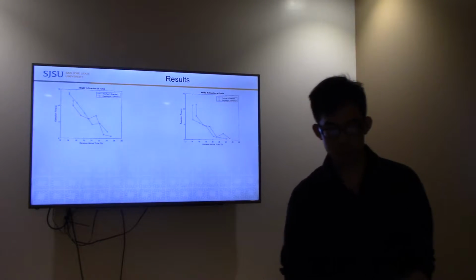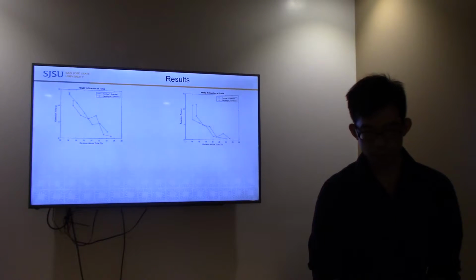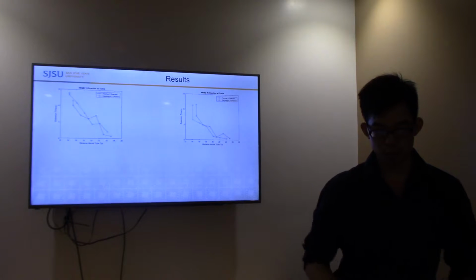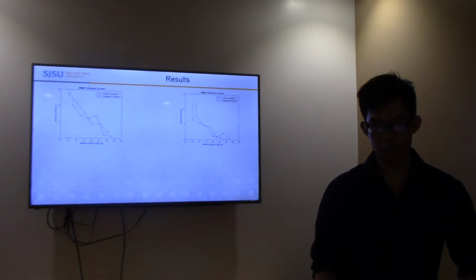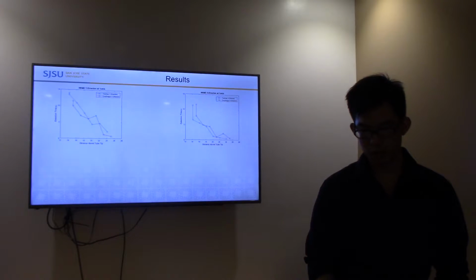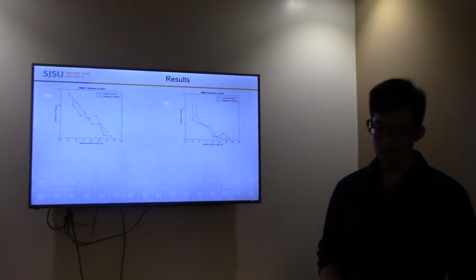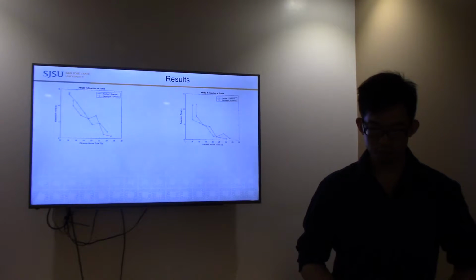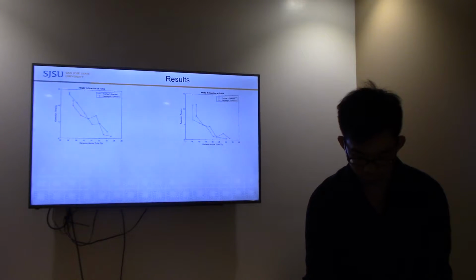So looking at the results, comparing the x and y direction, the y direction makes sense where the trachea, since it's in front of the esophagus, has a higher detection time than the esophagus. However, in the x direction, going from left and right, the esophagus has a higher detection time, which isn't what we thought it would be, or what we want either.